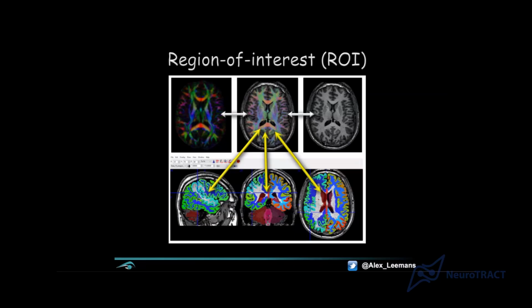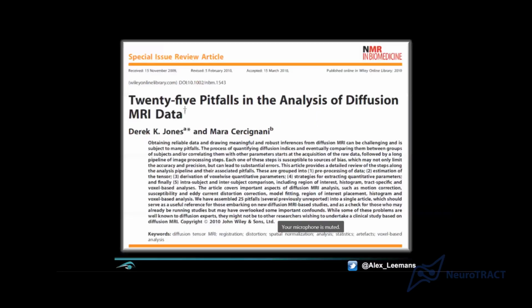But if you take a bigger ROI, registration-wise, it might not be perfect. And by that I mean using the atlas like in a FreeSurfer analysis framework to segment out the regions of interest. But once you've done that for all the subjects and you've visually assessed that this region seems to be correct for these subjects, well, then you can do a statistical analysis. Then it makes more sense to me.